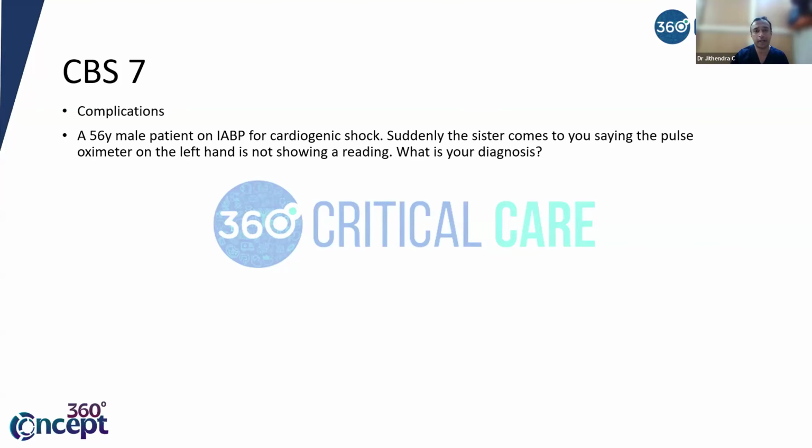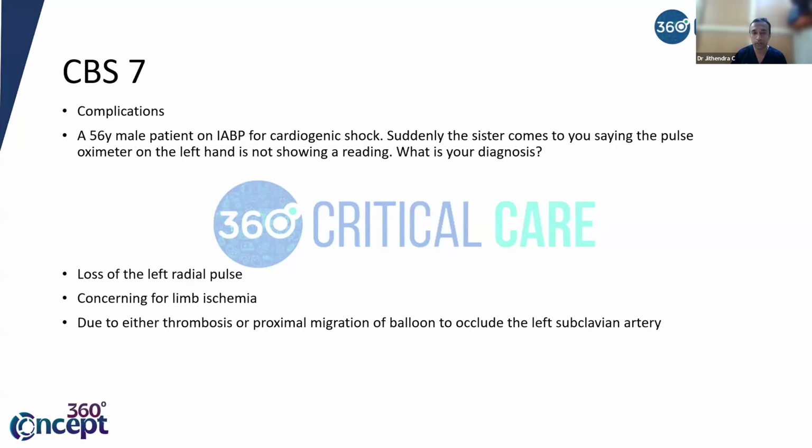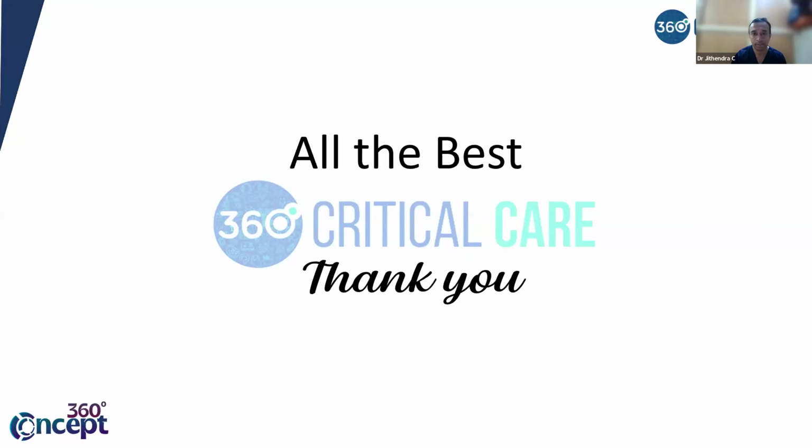And so that is not the only answer. One is malposition, everybody says. The other possibility is there can be a thrombus. Correct. That is another answer. Your first answer is definitely malposition. That is what you'll be thinking. So the next answer is you should think about any thrombosis happening, which should also be taken care of. Mainly we are looking for something occluding the left subclavian. Either it can be the balloon because of malpositioning, or it can be a thrombus which has formed because the balloon is sitting there for a long time. Okay. These two are the answers you can expect.